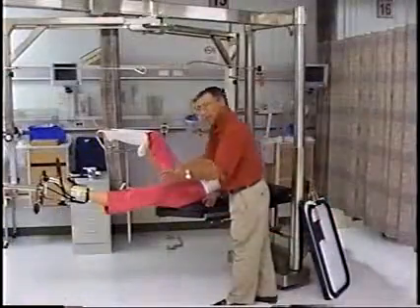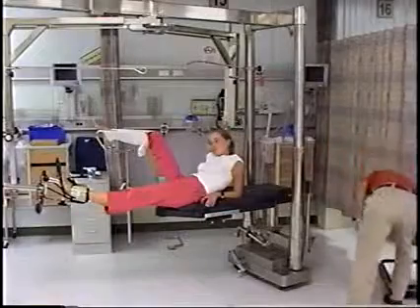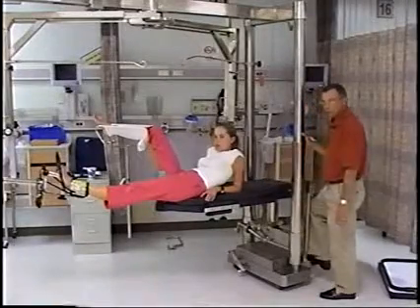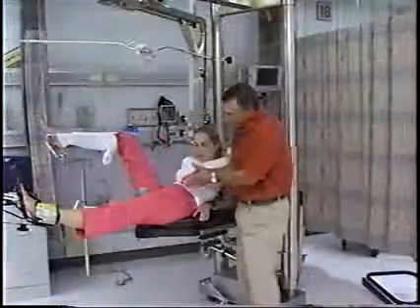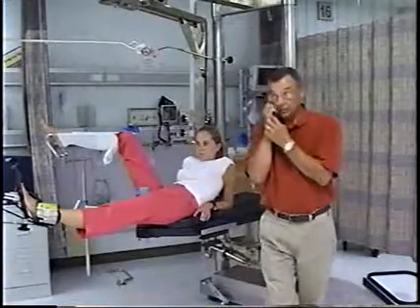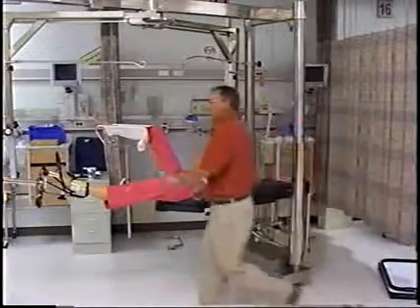All right? The only thing I didn't show you is that with a hip and a femur, the doc is probably going to want the table pumped up, the table top, as high as it will go, because he's going to want to look straight in at that hip, and he's going to want to look straight in at that femur. Okay? Questions? Do you want to show him the bracket, the release on the back side of that? Yes. Good point.